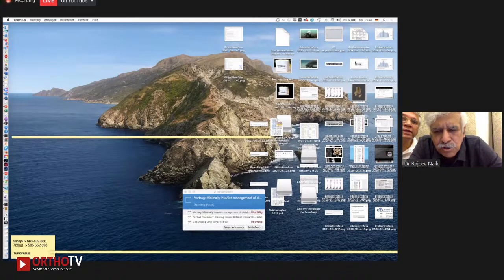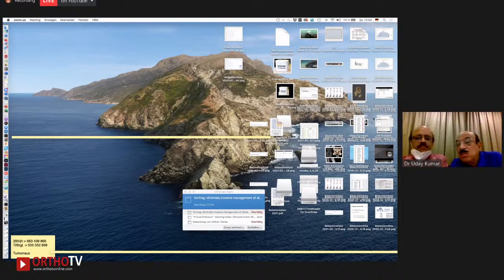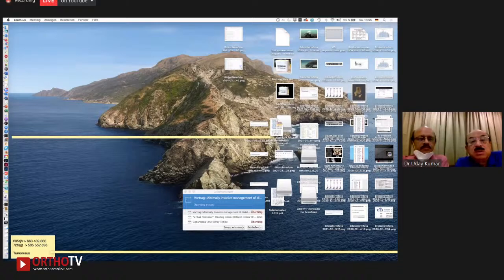Okay, good. Do you do the surgeries on plane table or on traction table? All on plane table, radiolucent table. I make sure I can flex the knee by letting it hang off the table on the fractured side a bit, so I can flex it. But it's very important that you have undisturbed radiographic control. And we are placing the contralateral side on an obstetric leg holder. This keeps the contralateral leg out of the way, and we have very good lateral C-arm exposure.